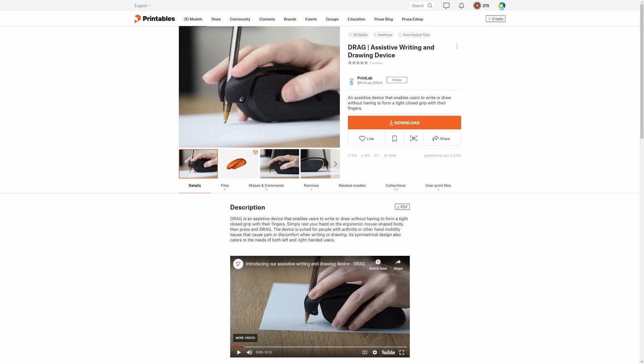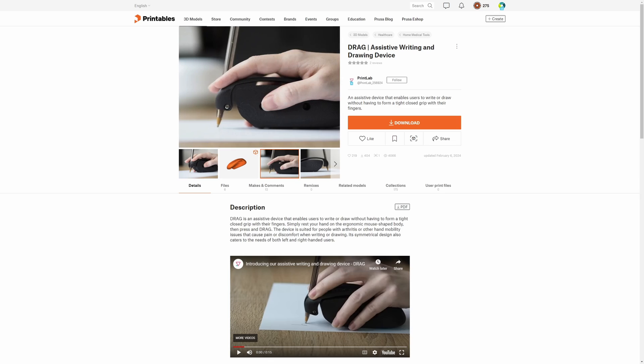Hello everyone, it is Wednesday, and time for another Weekly Builds episode where we find something new and cool to print. This time we're checking out Printlab's Drag. This is an assistive writing and drawing device.